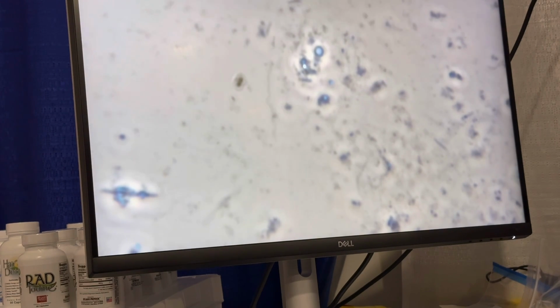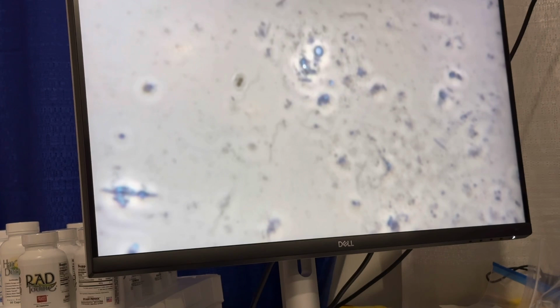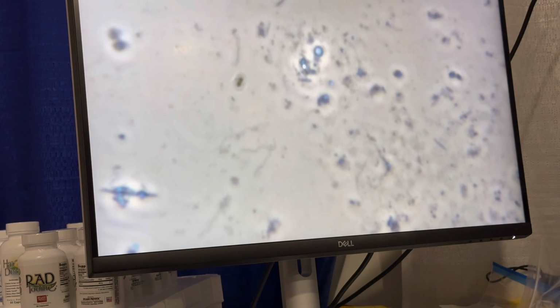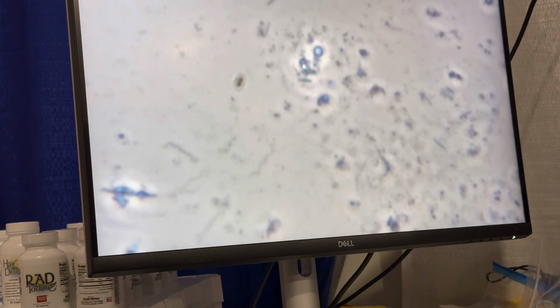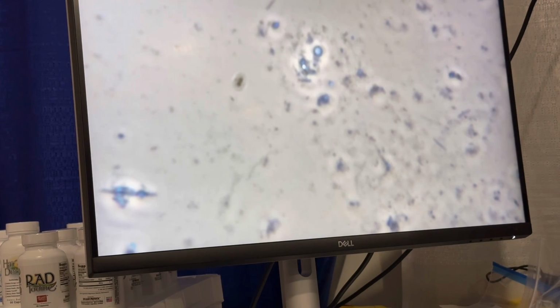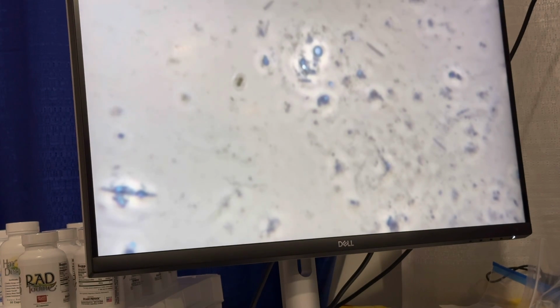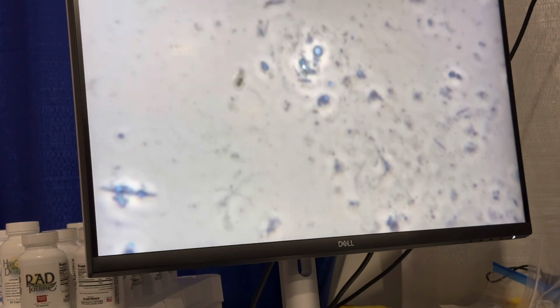You either scrape the inside of your teeth until you get enough plaque. It's got to look white, plaque with saliva. Look at those spirochetes. Crazy. And then you take the other one and you take the pointy part and you scrape the plaque. It's got to look white, plaque in the middle of the slide, then we'll put a cover slip.